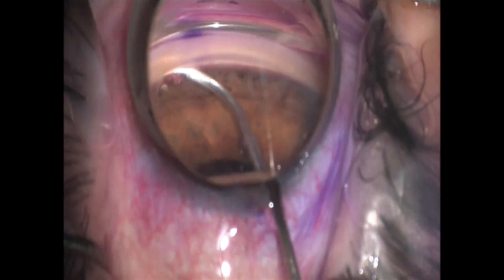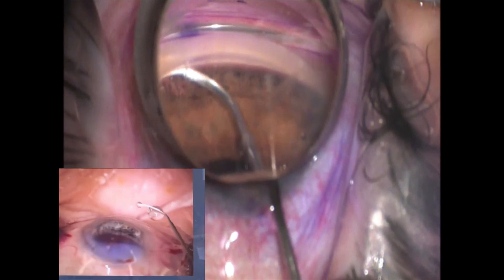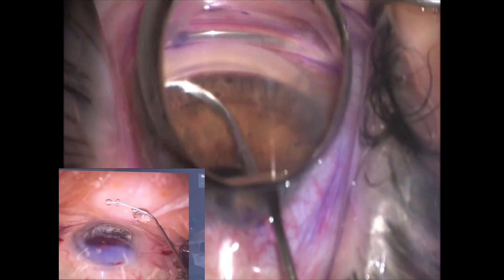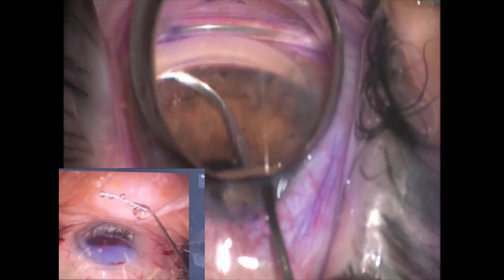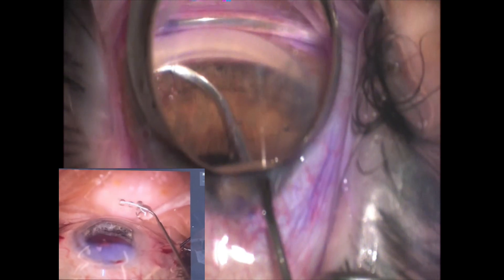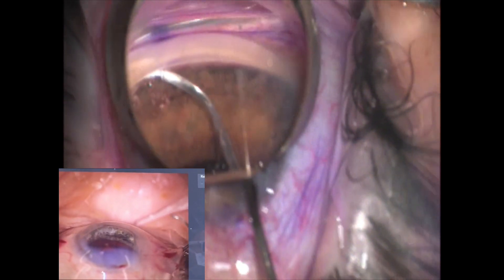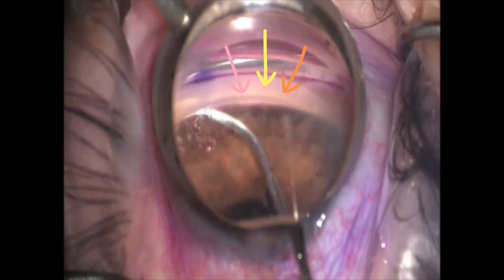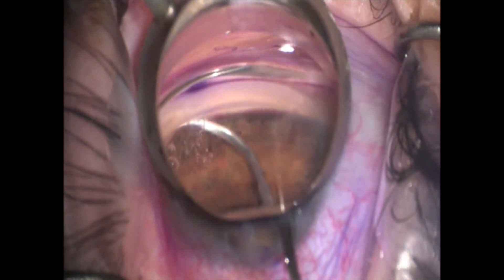Here's a video showing you the one truly unique thing about this device: the viscoelastic instead of just coming out the front part of the catheter is also coming out three side ports, shooting viscoelastic in seven different areas as you scroll through. If you look at those arrows, you can see a little white thing moving across — that's the 360 coming a full 360 degrees.